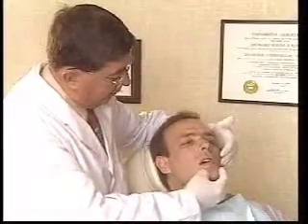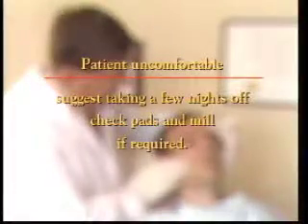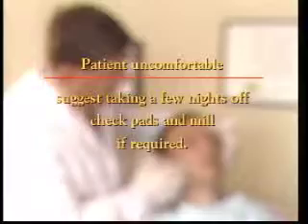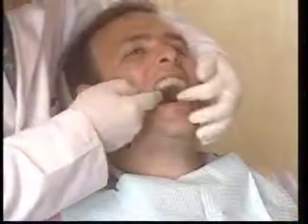If the patient is fighting the silencer or clenching, suggest that they take a few nights off. Also check that the bite pads are balanced. If the problem is tender anterior teeth, the silencer may be too tight. Check for undercuts and also check the clasping.